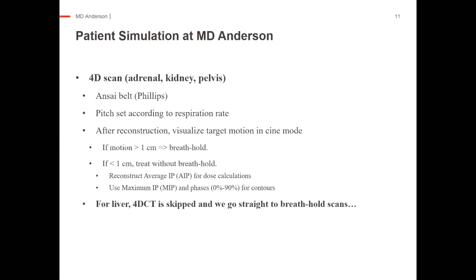So we use an Anzai belt because we use a Philips scanner. It has a good integration. We set the pitch according to the patient's respiration rate. So we take the 4D scan and then we reconstruct it and we play the scan in cine mode at the target location. And we evaluate the motion of the target itself.